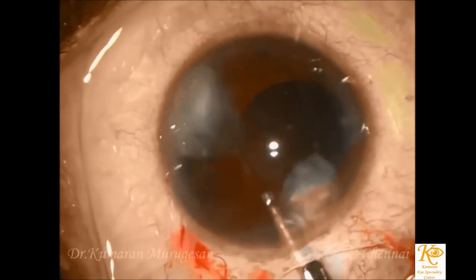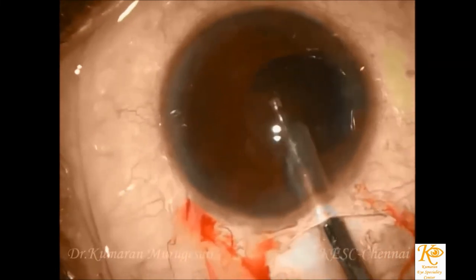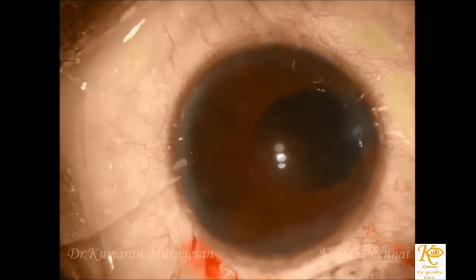Here only one end of the nucleus is prolapsed, allowing space for the insertion of the irrigating vectis to go beneath the nucleus, as prolapsing the entire nucleus would sometimes cause zonular dialysis.